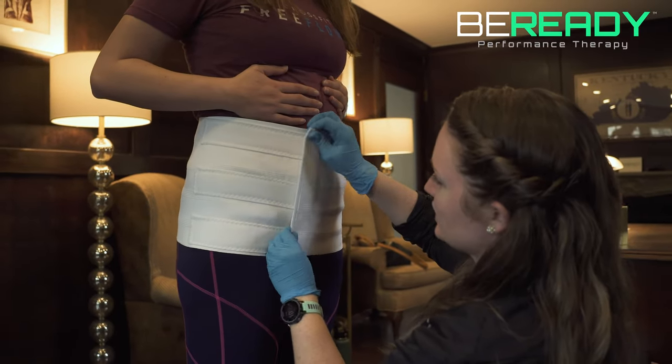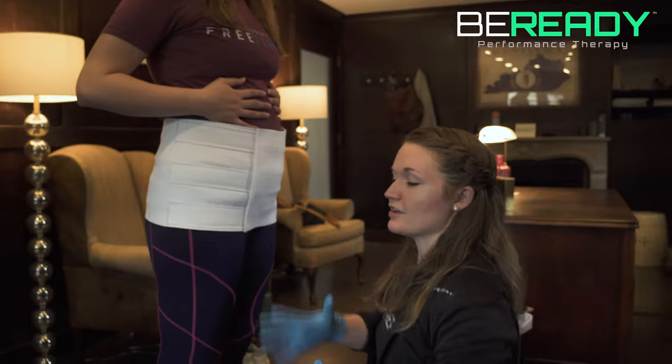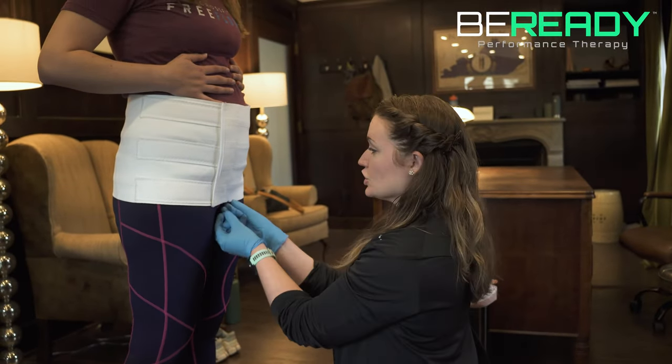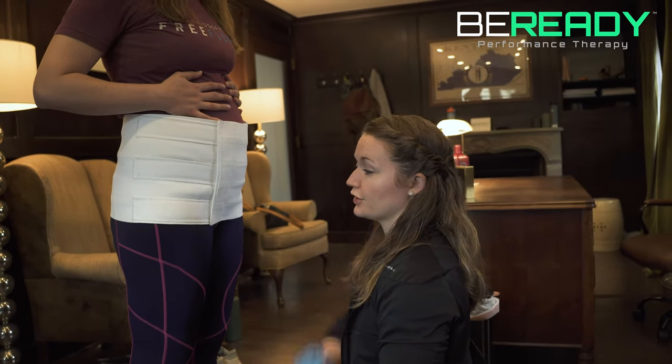In terms of tension, you don't want it to be so tight that you can't take a normal breath in and out. But we also want it to be snug enough that it feels like it's giving your incision a light hug or lift. Double check that the bottom of this is right at your pubic bone and below your incision.